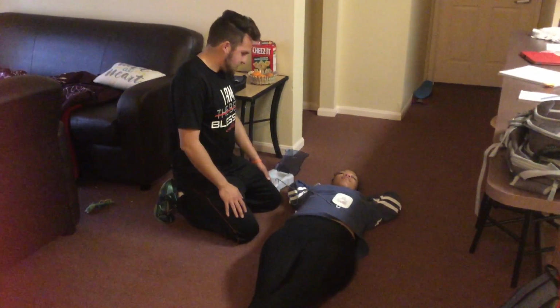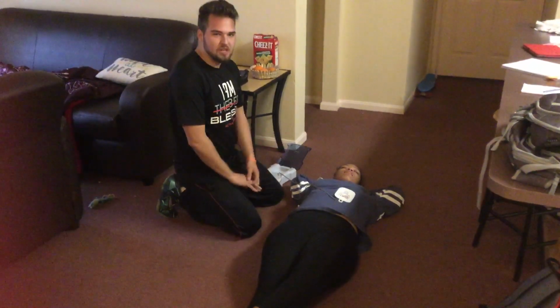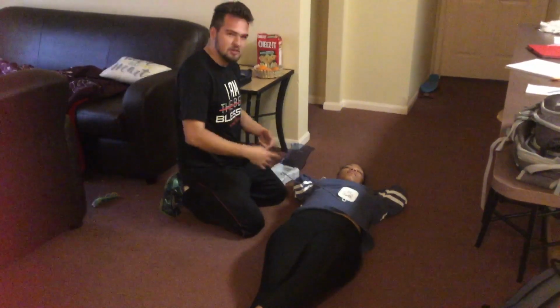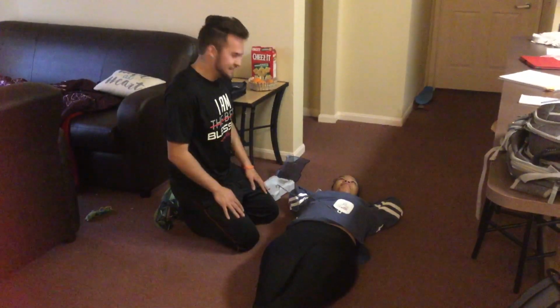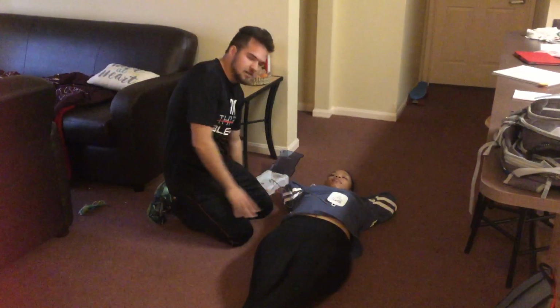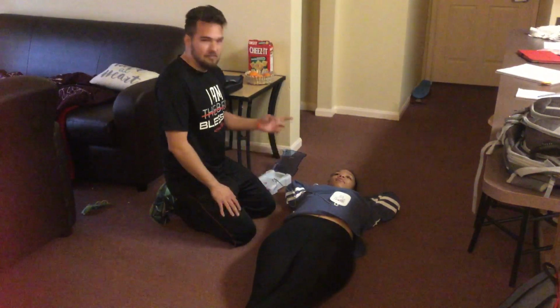Then CPR. And the AED even gives you a metronome, a little beat of when you should be giving your compressions. So right here, and that should be 10 right there. Keep going to 30 with those 2 rescue breaths. At this point, if the patient does regain consciousness, begins to start breathing again, or shows a pulse, we would stop using the AED and just monitor the patient, make sure that none of the symptoms change. Wait for EMS to arrive.